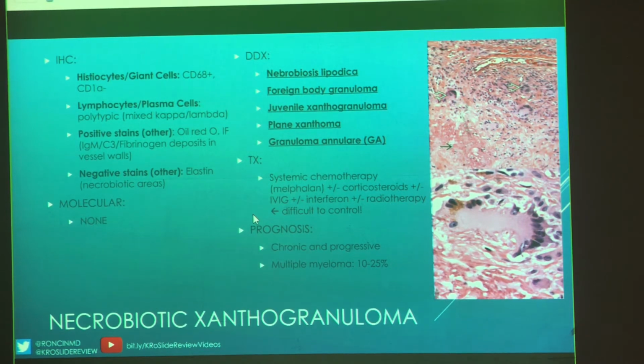Again, our differential: necrobiosis lipoidica, is this a juvenile xanthogranuloma? Is it xanthoma? Is it granuloma annulare? Is it a giant cell or foreign body granuloma? So lots of things to think about. And with these, they actually will treat them with systemic chemotherapy. They may or may not give corticosteroids. They may or may not give IVIG or interferon or radiotherapy.